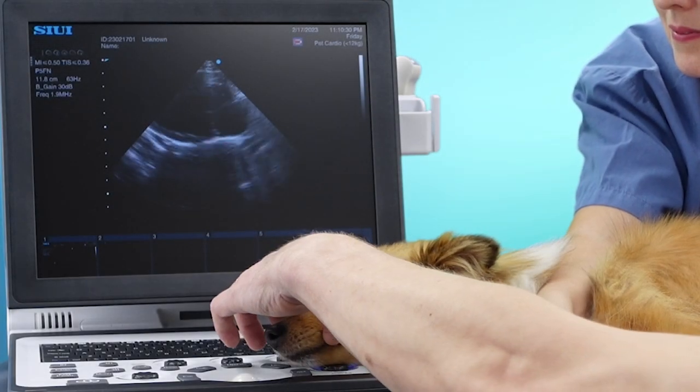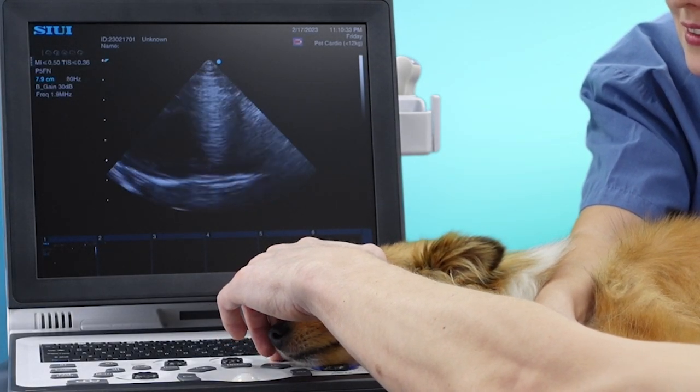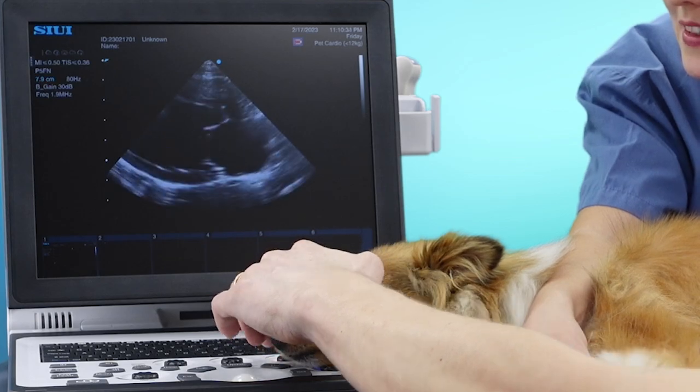And of course, we will look at optimising your main controls. That's depth, frequency, gain and focal point. These should be optimised for this view, and you will need to change them again in subsequent views.